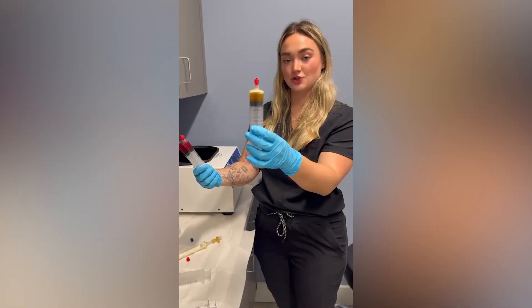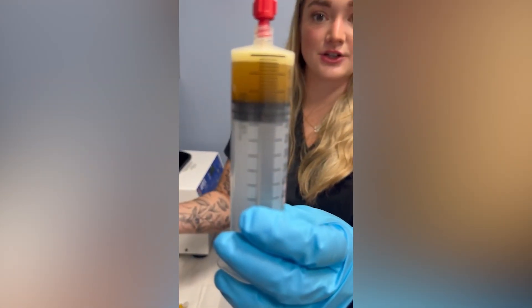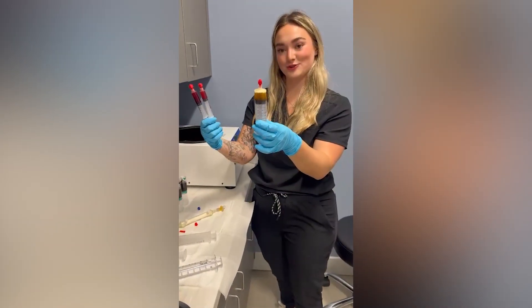The protein concentrate is what we call liquid gold. It has all of your macromolecule levels, your proteins, growth factors, and it helps to enhance the PRP and leads to better results.